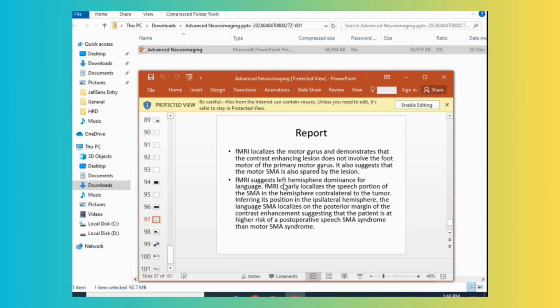For example, if you go to head and neck MDT, they will stop you forcibly: don't tell me this thing, I don't need this, just tell me. They will tell you that, is the carotid artery resectable or not resectable. Next case, we don't have time to listen to your verbose reports.